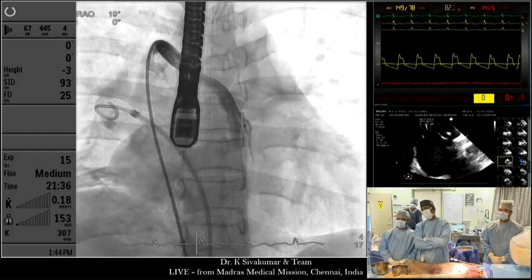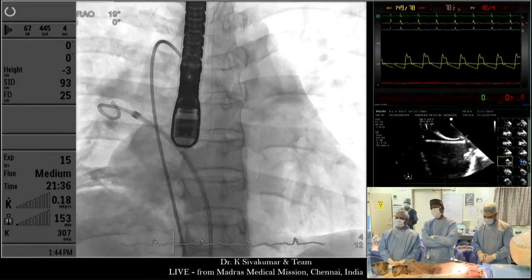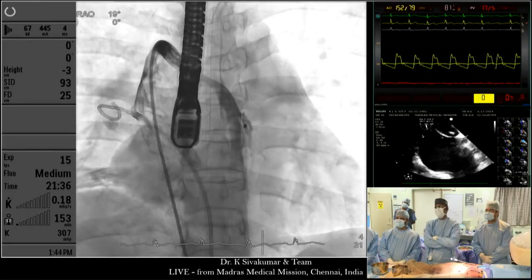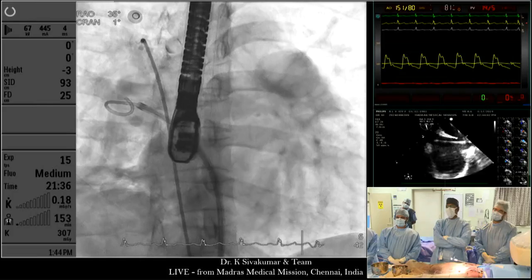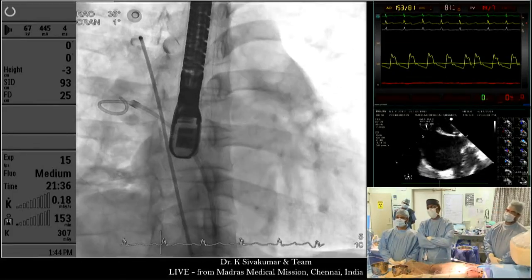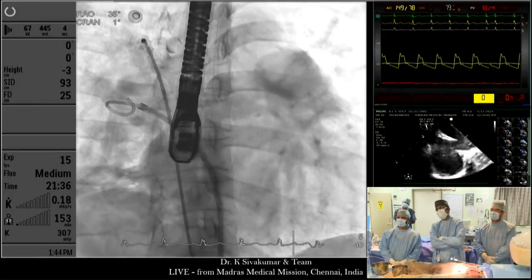Then from the right femoral venous catheter, we advanced a catheter into the azygos to locate the position of the azygos. Next picture. Then we knew that there was an additional pulmonary vein, so we cannulated that additional pulmonary vein. So the right femoral venous catheter is in the right additional pulmonary vein, and the lower catheter is in the main pulmonary vein. The main pulmonary vein is obviously 4 times as large as the additional pulmonary vein.